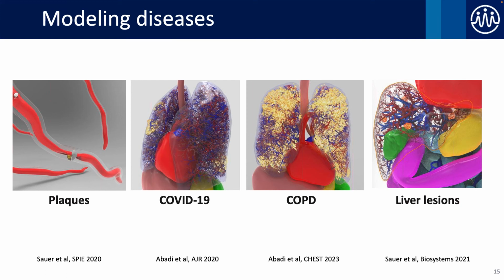And then we do this for a variety of them to make sure they're representative. So we are not creating only one lesion or one demonstration of emphysema, but rather we create a variable rendition that would give you different extent, different size, different distribution, different material, so that you are basically mimicking the representation and the diversity that you would see in your clinical practice. So disease modeling is also important, and with this, you would have a population of patients virtually, which you can use to study. But what is the next step?